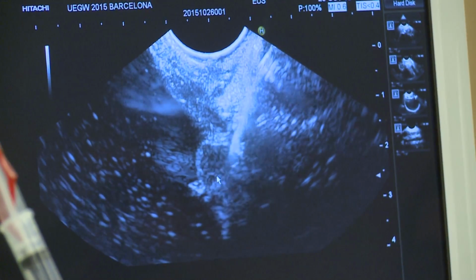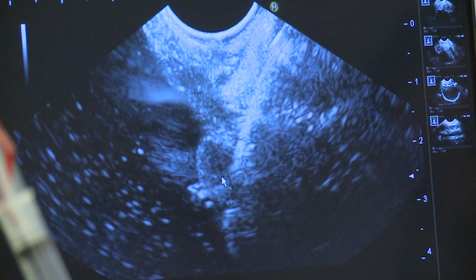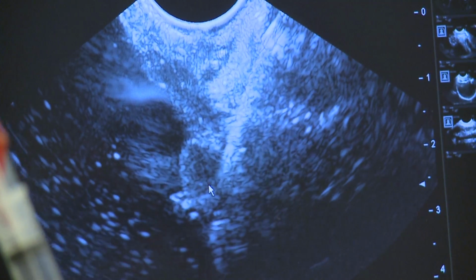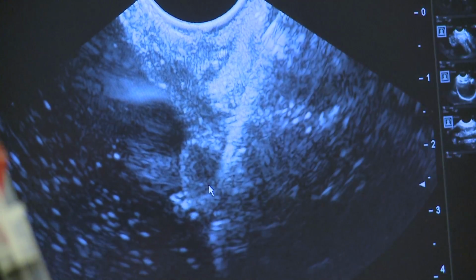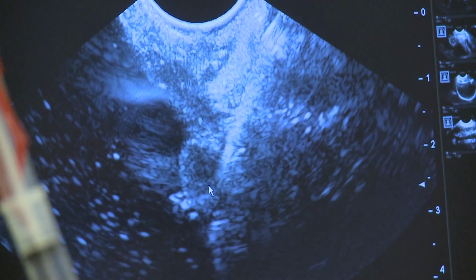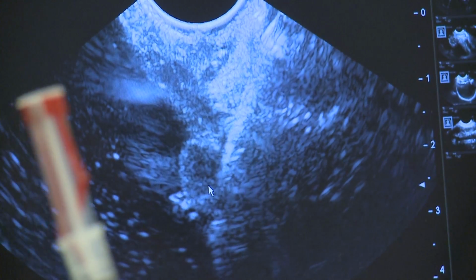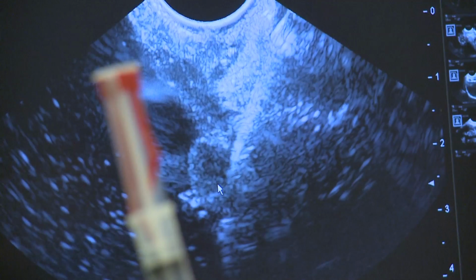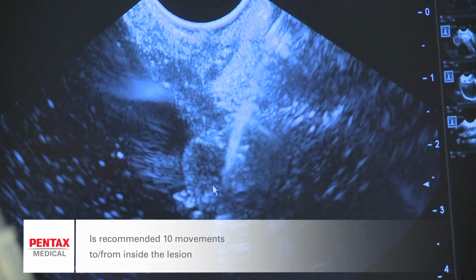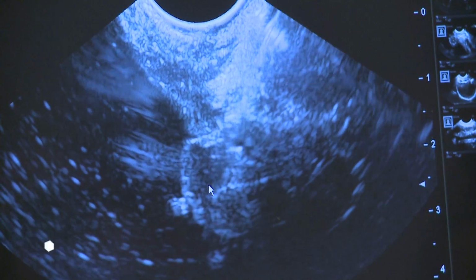So I'm here doing the FNA, you see, going in and out. Those are the so-called to and fro movements, okay? You can manage to do 10 to 15 to and fro movements, but each time you remove the needle and put it in again, that's a pass. So the number of passes is not the same as the to and fro. It's also been measured how many to and fro movements are needed, and the study said there need to be at least 10 to and fro inside of the lesion. And it's better, of course, if you perform it changing the positions.